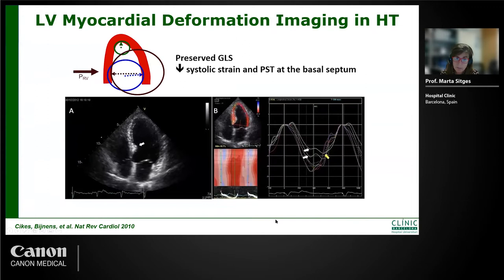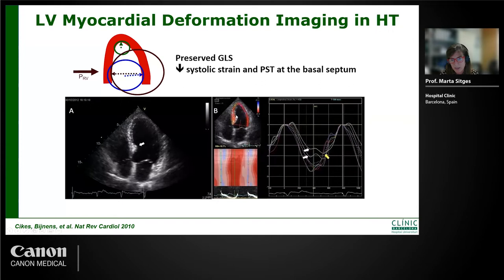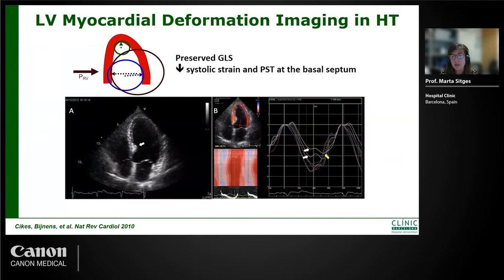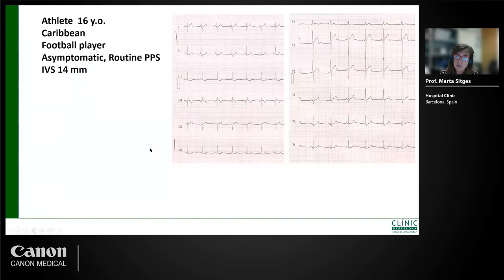In hypertension, as in the athlete I showed before, we have typically increased septum thickness with concentric LV hypertrophy. The post-systolic thickening in the basal septum appears because this area has more wall stress and is more susceptible to increased afterload. The athlete was recommended to be checked for hypertension, and even during exercise testing, we recommended controlling his hypertension.